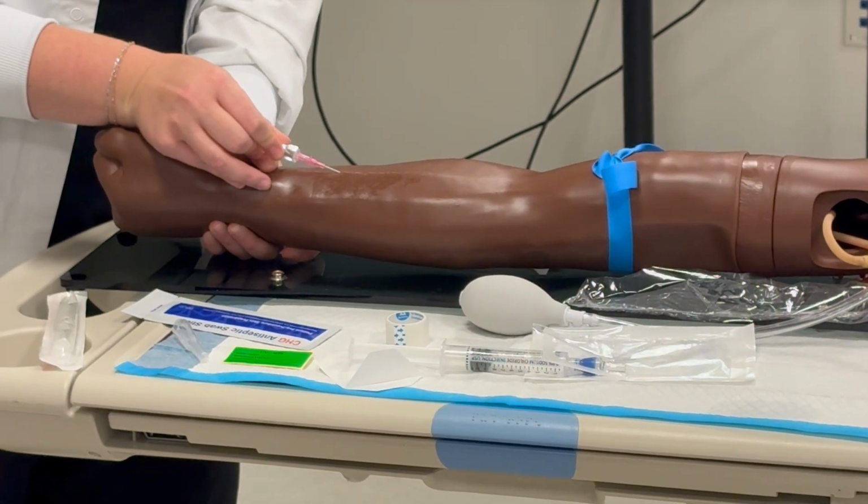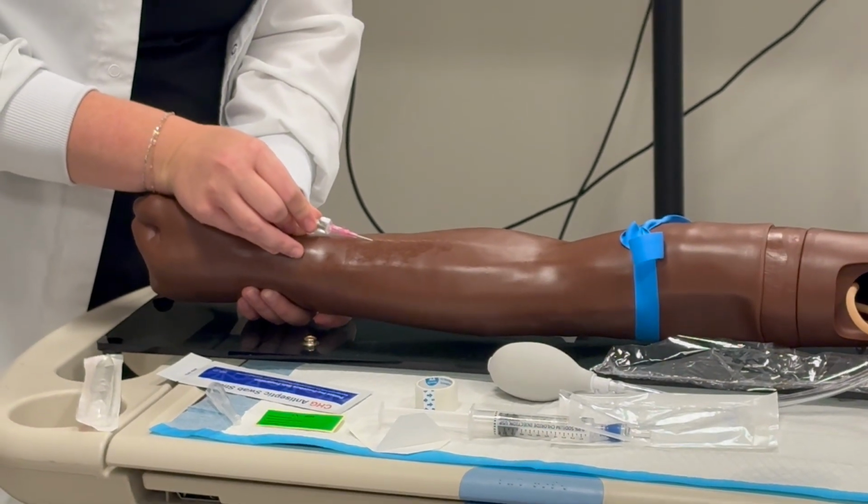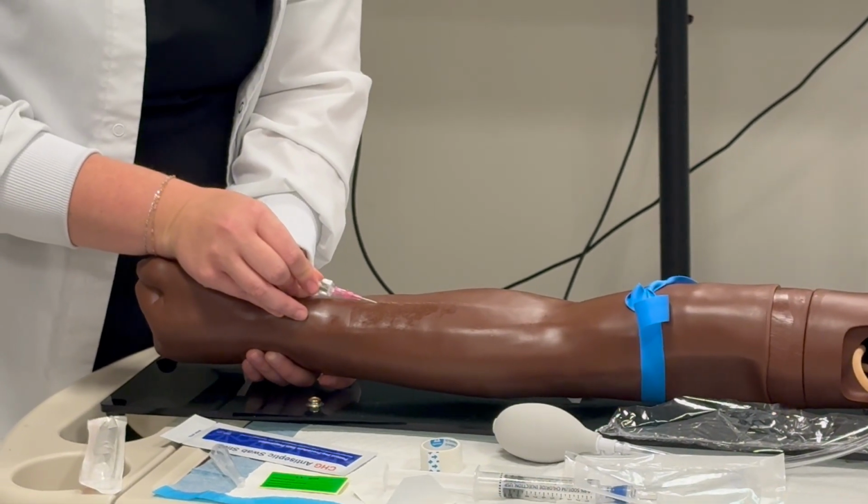What am I looking for? Blood return. Now, blood return on our mannequins, even though it looks really red in there, it's very pink. So I'm going to pull out a little bit.